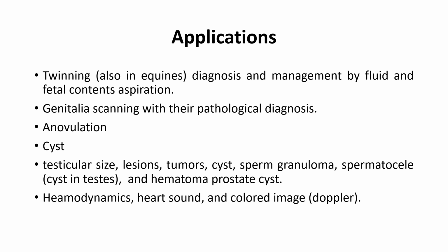Testicular lesions, testicular size, tumors, cysts, sperm granuloma, that is accumulation of sperms in the testes, spermatocele, and hematoma, and prostate cysts can be diagnosed. We can also observe hemodynamics, or movement of the blood, through Doppler ultrasound. We can detect heart sound and can get the colored image by Doppler ultrasound.